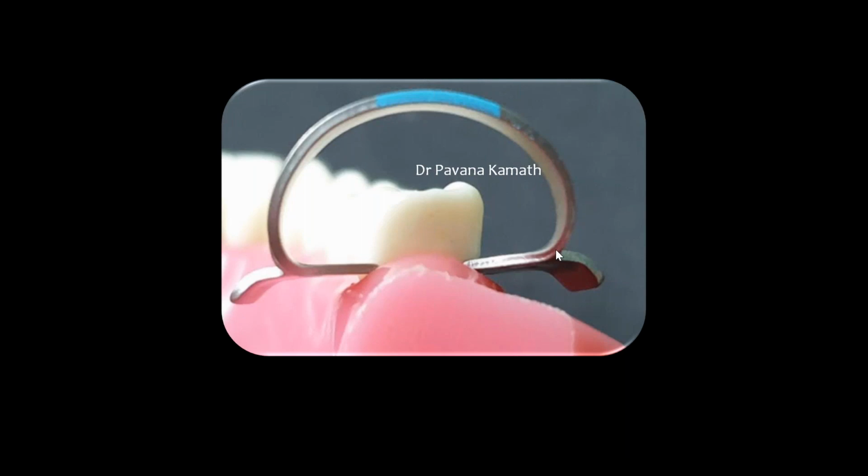Now, I haven't described the clamps in detail because we've had enough webinars discussing the basics in detail. Just to make you familiar, that's the bow and these are the jaws. And this is a winged clamp, where you have a wing-like extension. You can clearly see the benefit of having a wing-like extension. It retracts your rubber dam and the soft tissues up to this level, so you get a greater space of work as against wingless clamps.